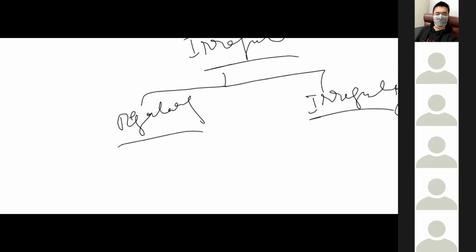That is, you find the QRS complexes along the entire ECG.